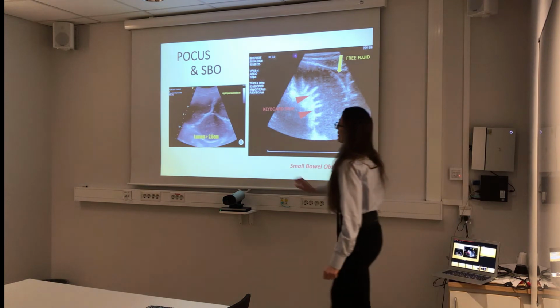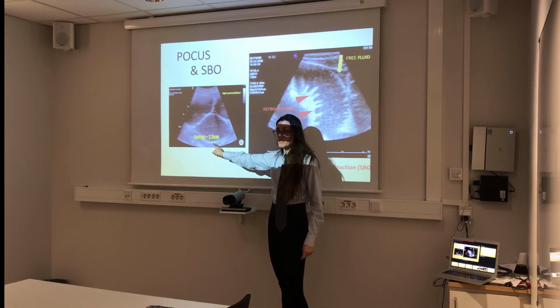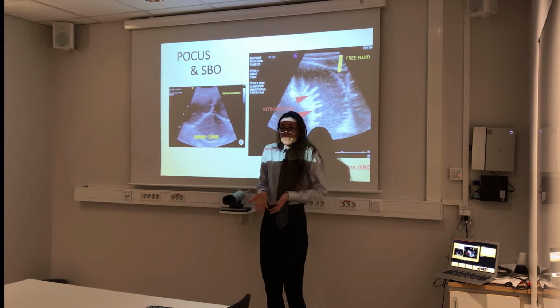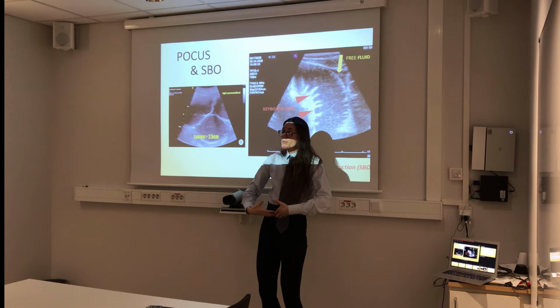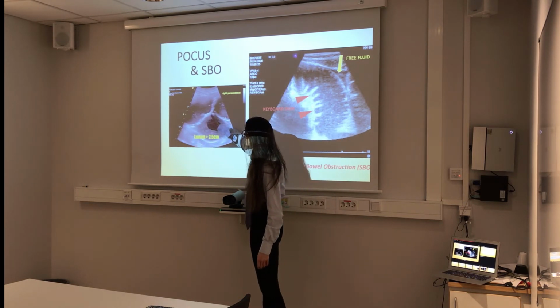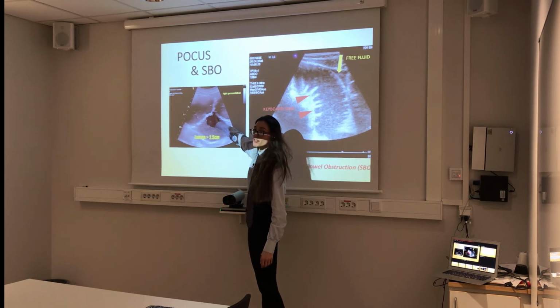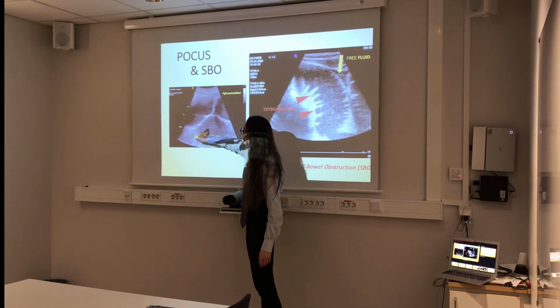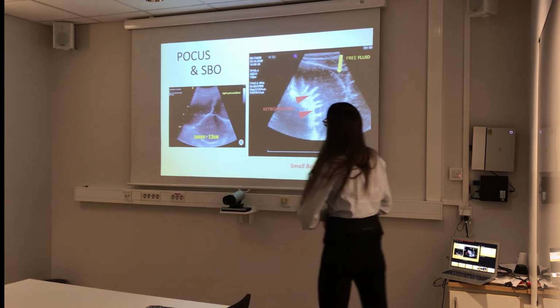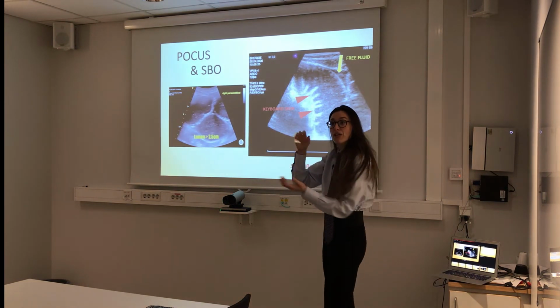Here we go. What I told you, you will really find it. It's very straightforward because what happens basically is that these bowel loops pop on the surface. So if you put a vascular probe, you get it straight away. Again, the distance in between here and here is more than 2.5. There is a little bit of free fluid in between. And this peristalsis, which is again to and fro, very lazy peristalsis, okay? This is a small bowel, this is not normal. Small bowel is completely collapsible, yep.